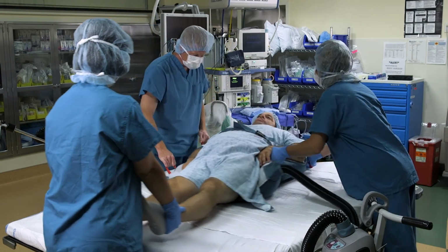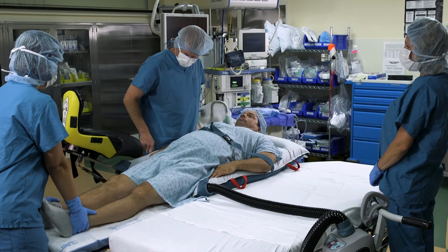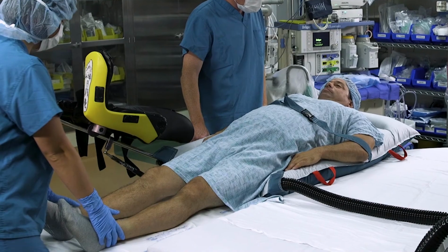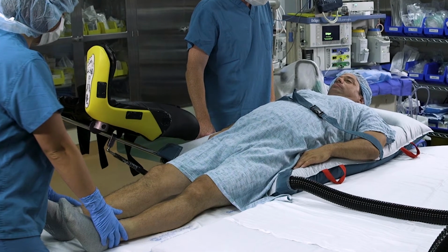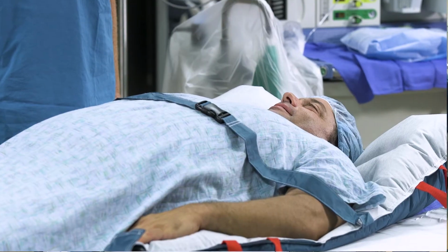The caregiver holding the patient's ankles and feet should move with the HoverMatt to facilitate a smooth transfer. Once positioned and centered on the receiving surface, the caregiver on the receiving side of the half-mat should assume the position of safety and have the caregiver at the foot end press the air supply standby button to stop airflow.